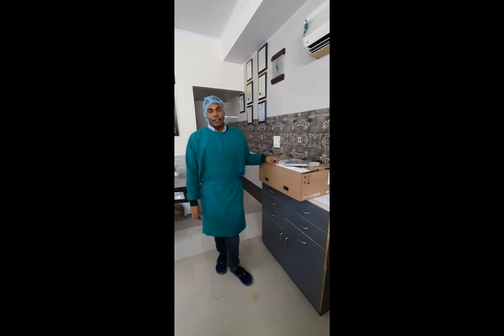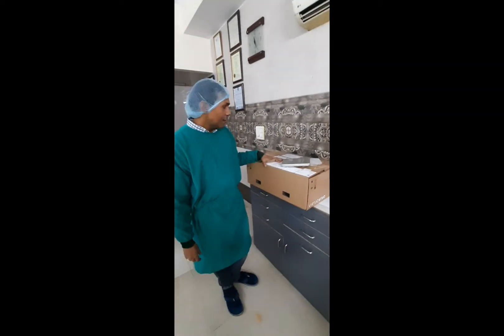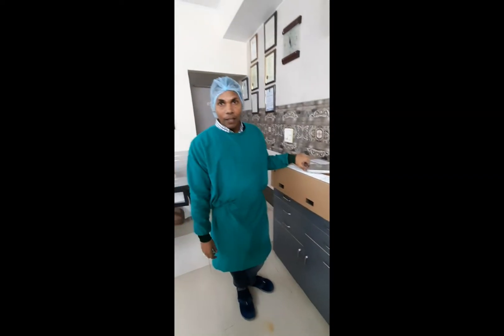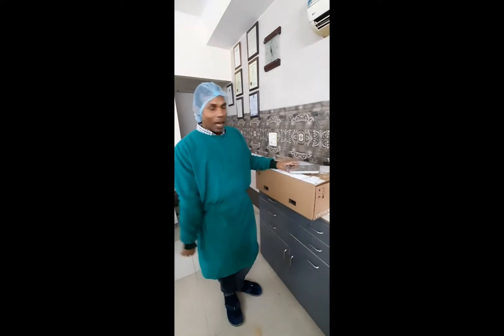Hi friends, I am Dr. Vijay Prakash and today I will be sharing with you a very important video — a brand new intraoral scanner by Stromen, that is the Virtue Vivo. We are going to unbox it and I am very excited to do that.